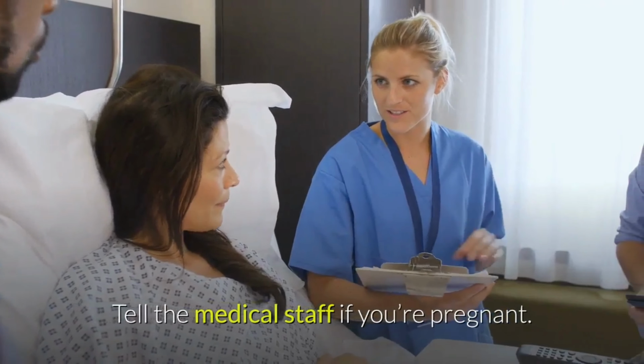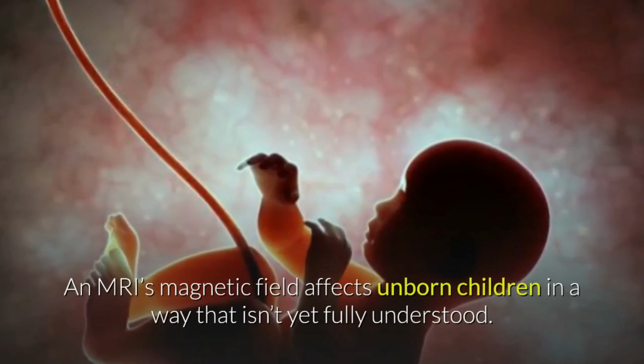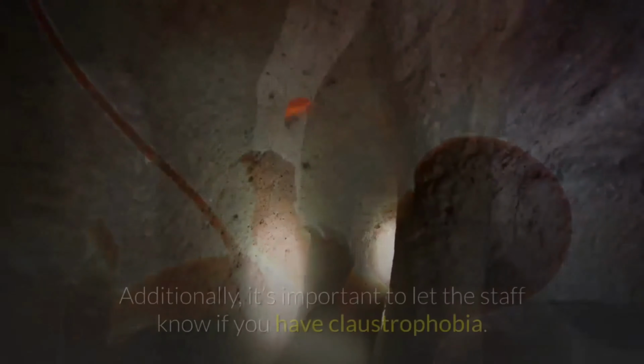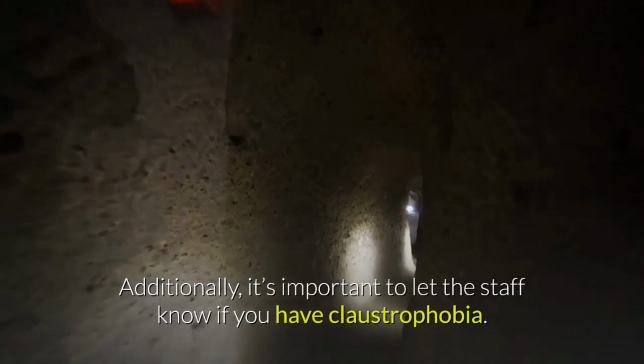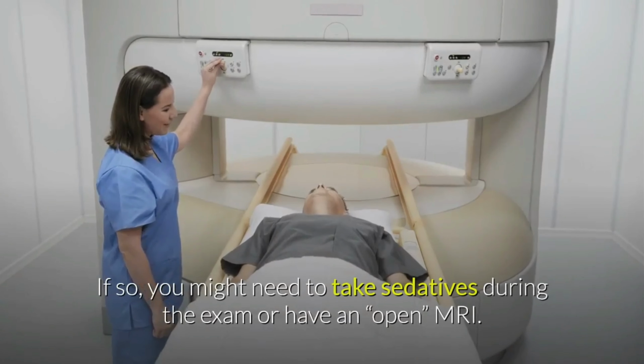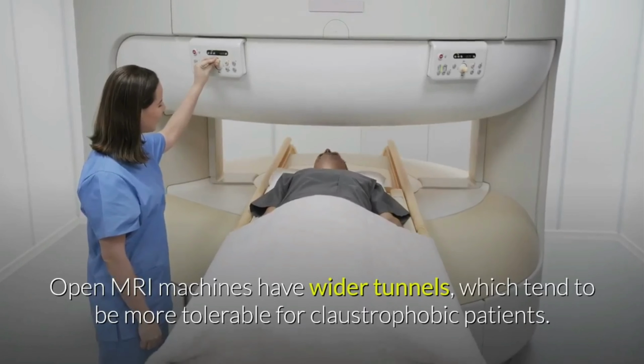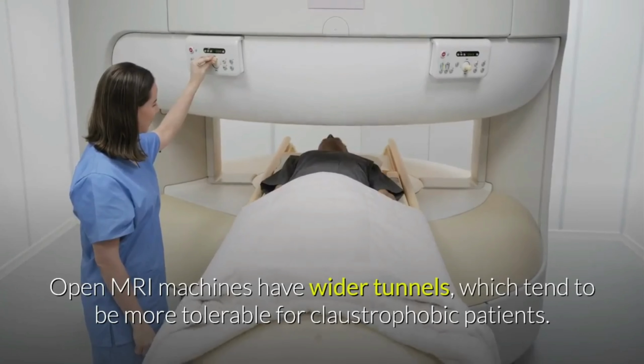Tell the medical staff if you're pregnant. An MRI's magnetic field affects unborn children in a way that isn't yet fully understood. Additionally, it's important to let the staff know if you have claustrophobia. If so, you might need to take sedatives during the exam or have an open MRI. Open MRI machines have wider tunnels, which tend to be more tolerable for claustrophobic patients.